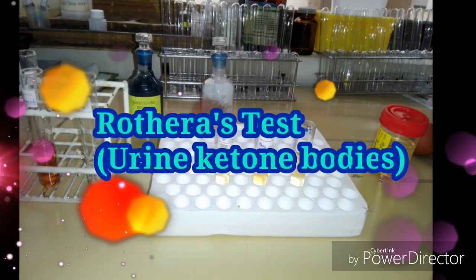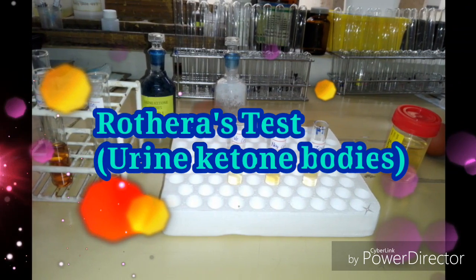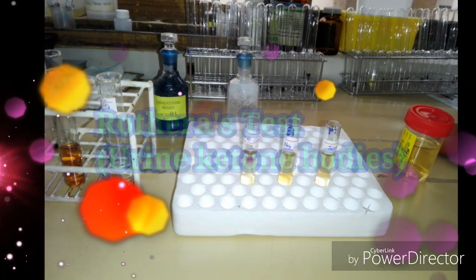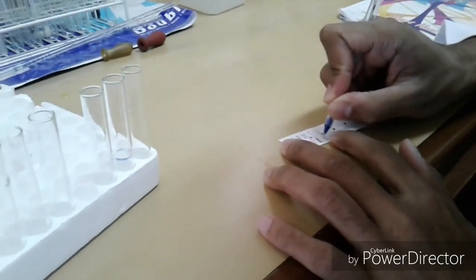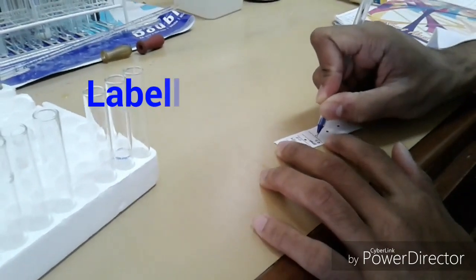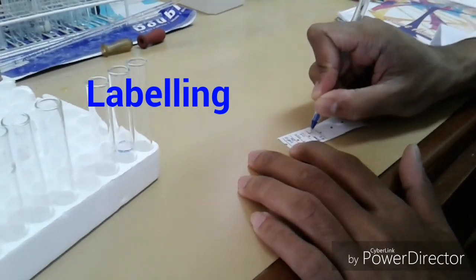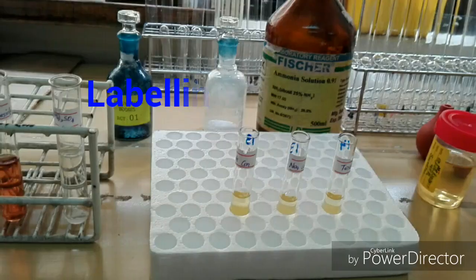Hi friends, welcome back to Star Laboratory. Today let's discuss the Rothera test, which is used to detect ketone bodies present in urine. As a first step, we take three test tubes and label them as positive control, negative control, and one for the test.